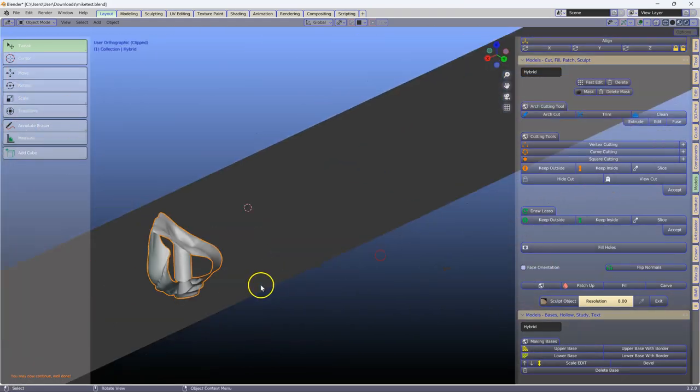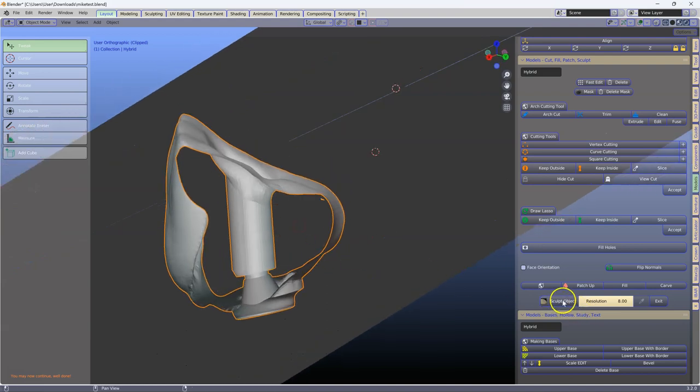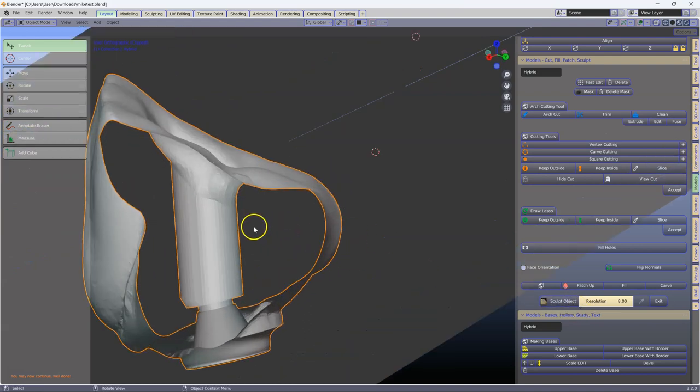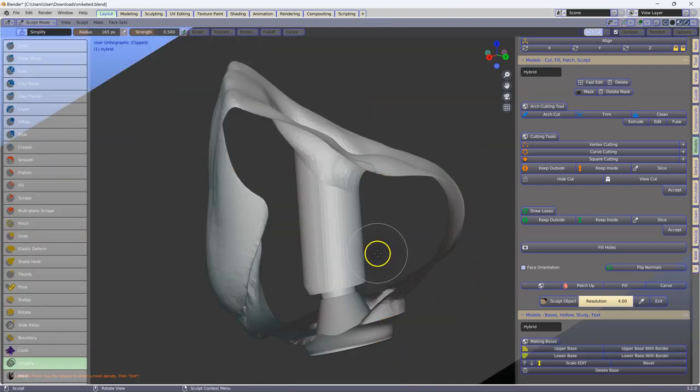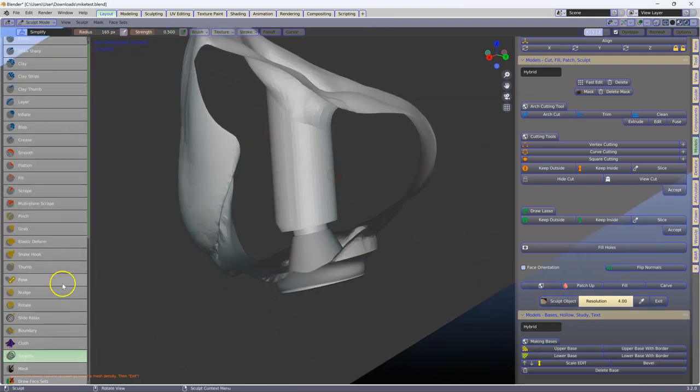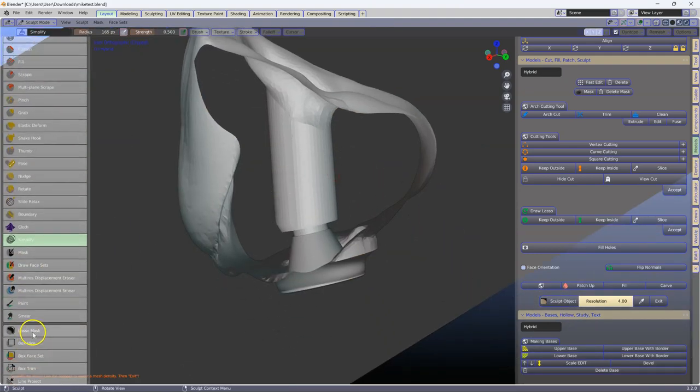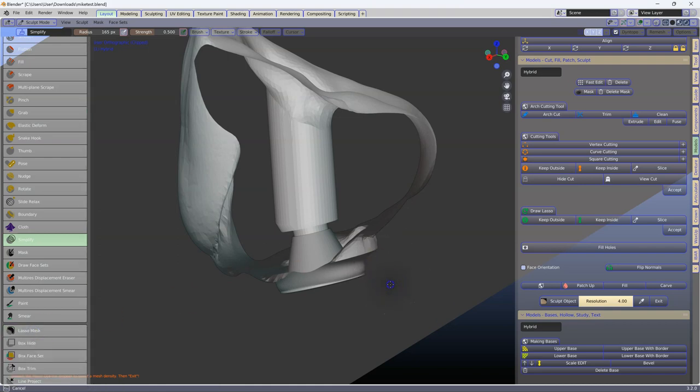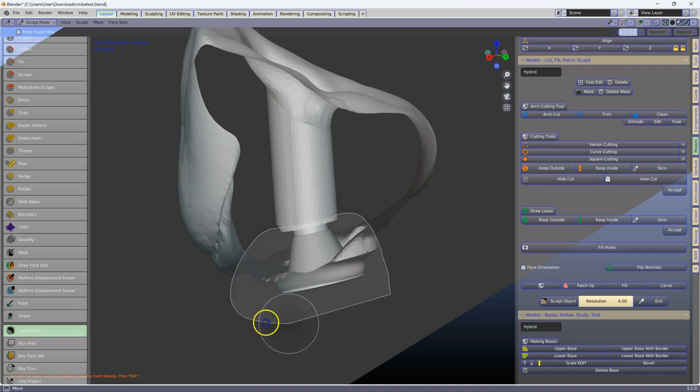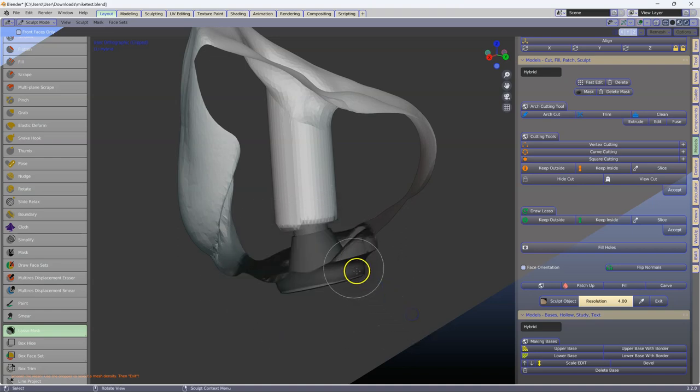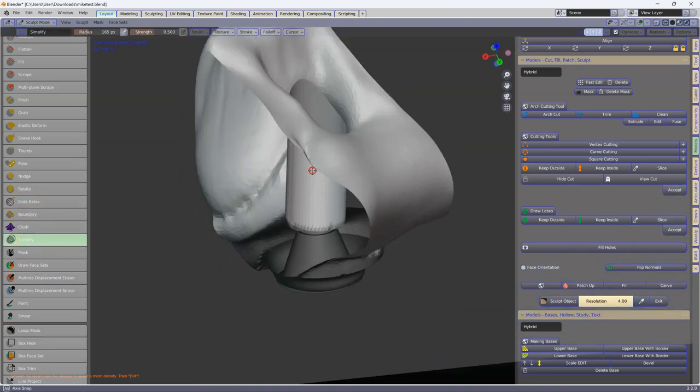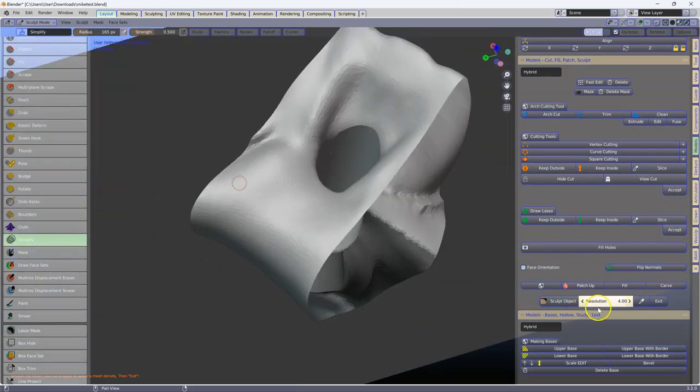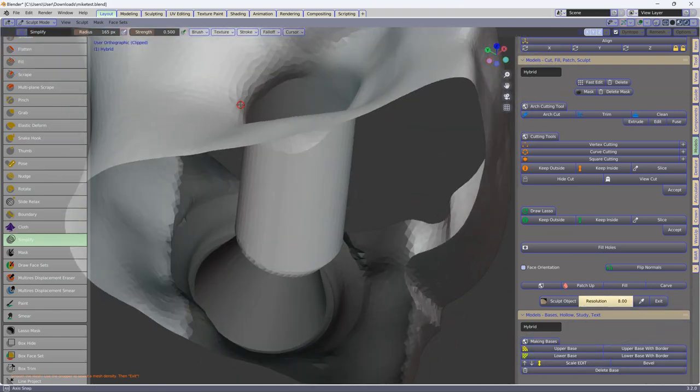Turn it 90 degrees, click on sculpt, you can actually see here, this is all defective. Go back to your lasso, select this part over here. Then, go back to simplify, and we're going to put this to about 8, which is quite fine, and we're going to correct this mesh.